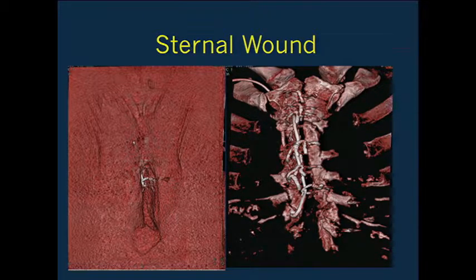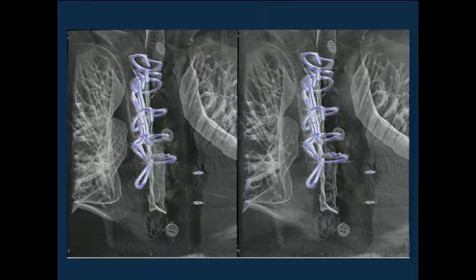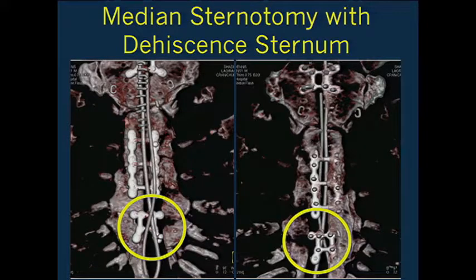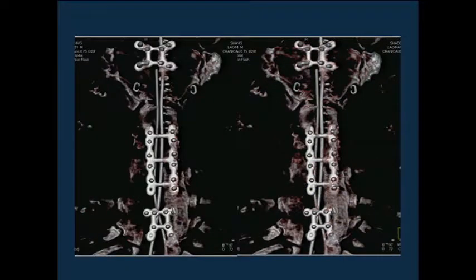Sternal dehiscence occurs in up to 7% of patients and is more common in difficult patients—obesity, patients on steroids, chronic renal disease, or reoperations are all predisposing factors. We've seen several cases where one of the sternal wires is pushing upward, causing local inflammation, breakdown, and often abscess formation. One of the nice things about post-processing the data is the ability to look at the orientation of the wires in both portions of the sternum, with color coding showing the mapping.